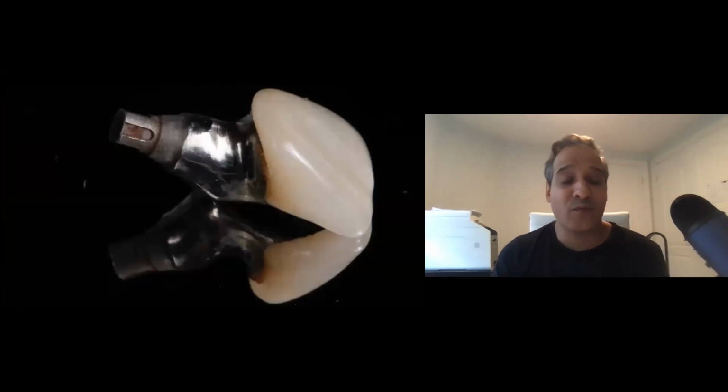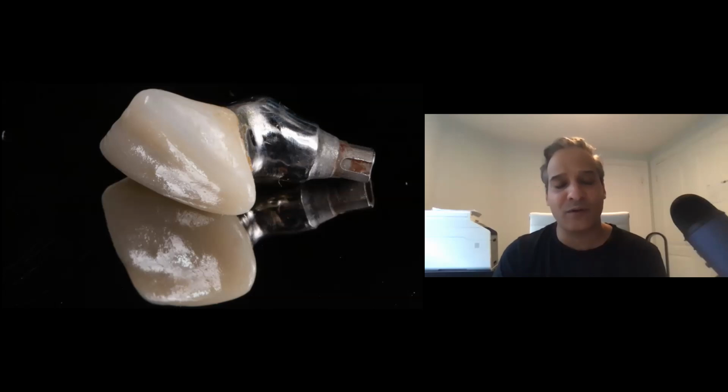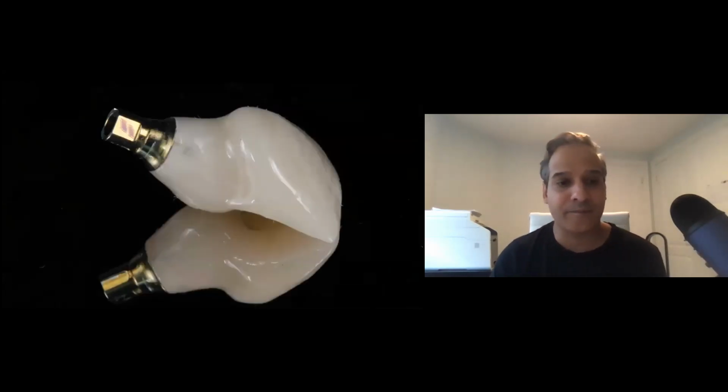So when I removed the crown, this is the way the crown looks. So you can see the ridge lap and the overlap. So our plan was, number one, I told her that you have to have a new crown placed, because the way this crown is shaped, it's part of the problem. The other issue, I said, is you have a ridge volume deficiency. You need to have some grafting done, a soft tissue graft, to plump up the volume.